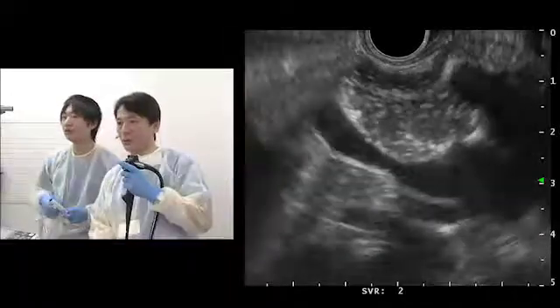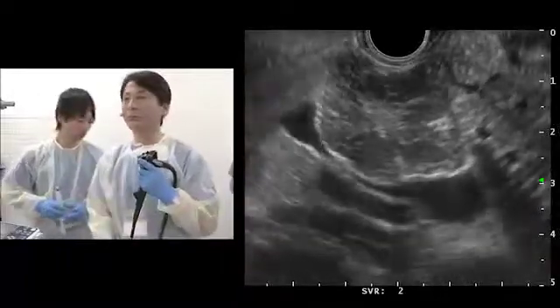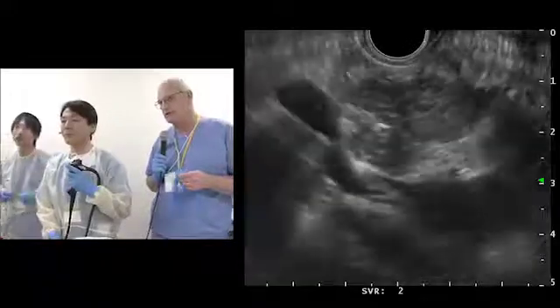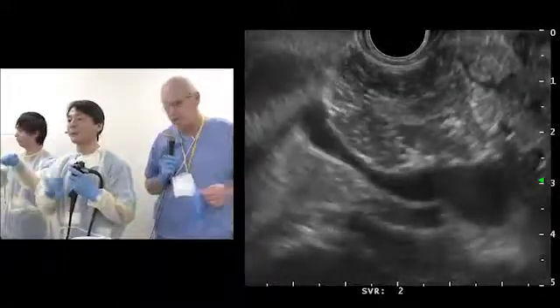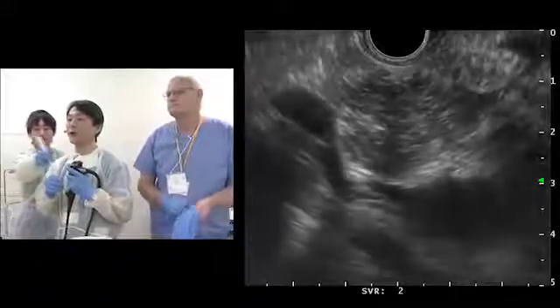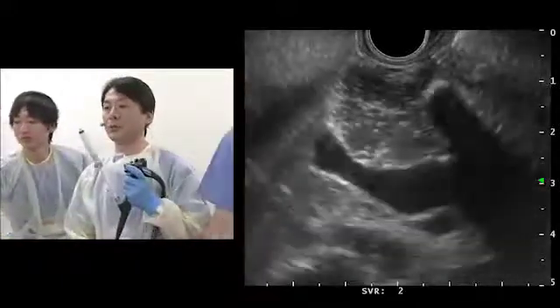I don't think there is any lobulation. I mean, I think the heterogeneity of the lesion gives you an idea of lobulation. I don't think it's encapsulated. I don't see a definite capsule around it. There's sort of echogenic, very irregular margins around it. Anyway, it is very difficult to say the diagnosis from imaging diagnosis. Thank you.